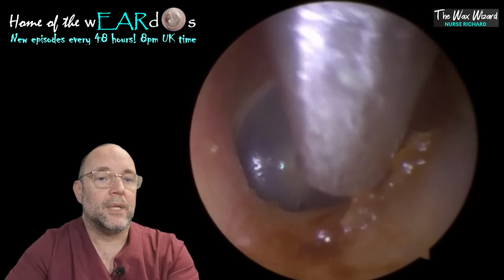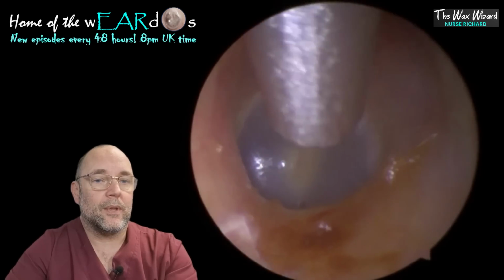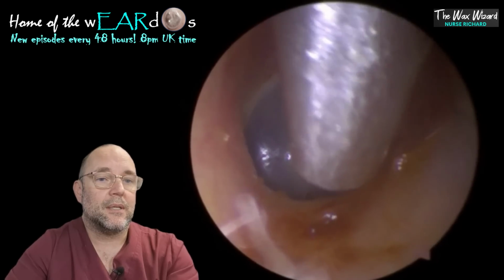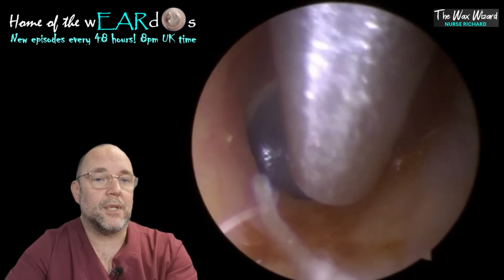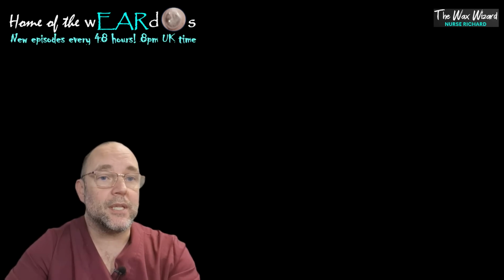Just tidying up these last little bits here. A lot of this is just remnants of the oil, to be honest. It's not essential. We just get a little bit of remnants there. And a lovely looking eardrum at the end of that.